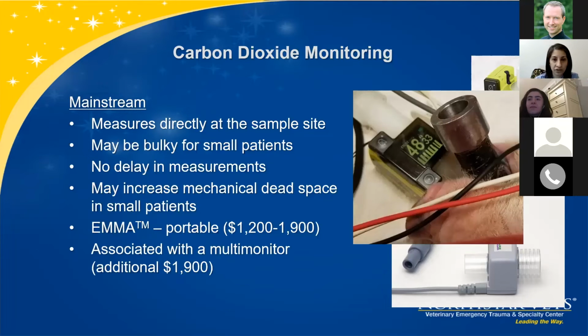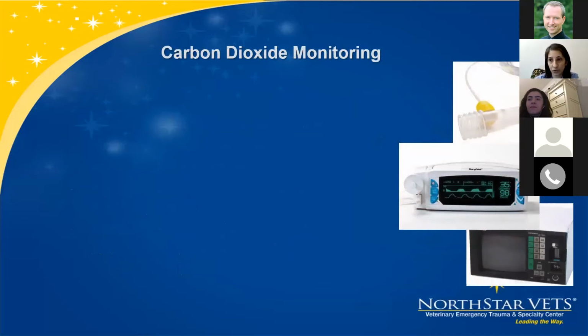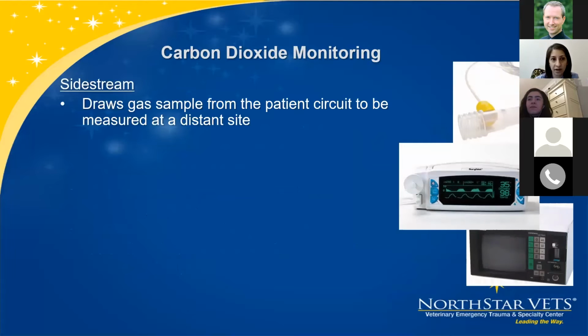If the mainstream capnograph is connected to a multi-monitor, usually there is an additional approximately $2,000 attachment for this unit on the machine. Probably more if you want to be able to measure other inhalant gases as well, but CO2 is probably the most useful on a general basis.